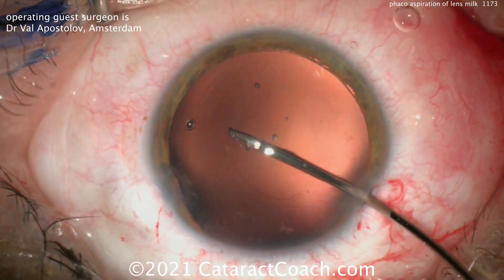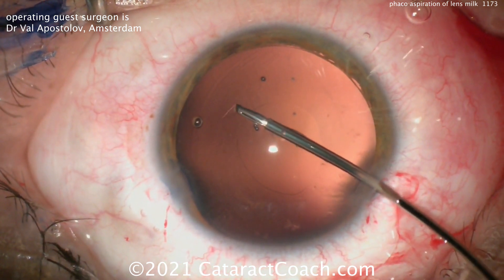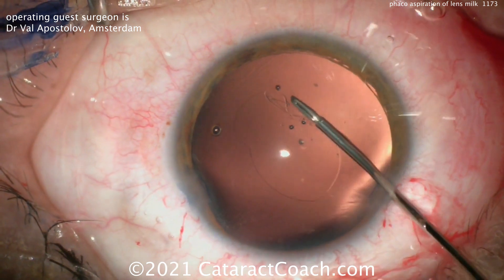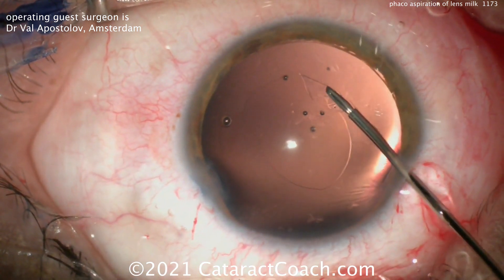Here I'll differ from Dr. Apostlav — I'd actually put the IOL in first if you can, because you can get these rolled-up IOLs through that small opening, and then you can tear the rexis right on top of the optic and know exactly how big you want to make it.